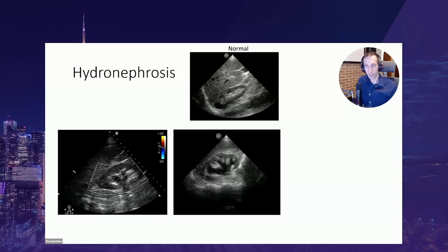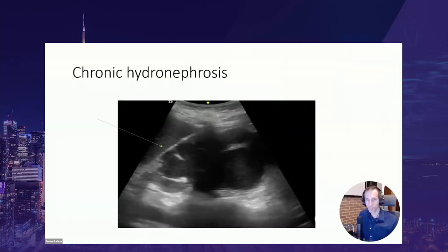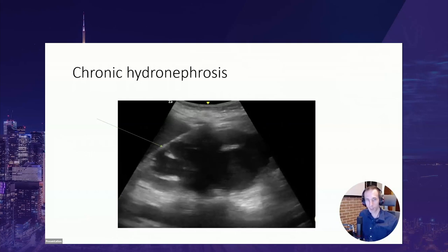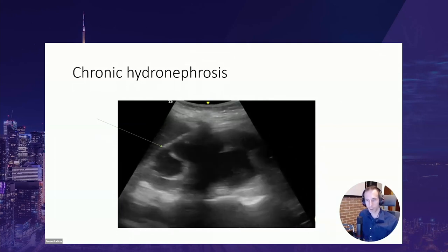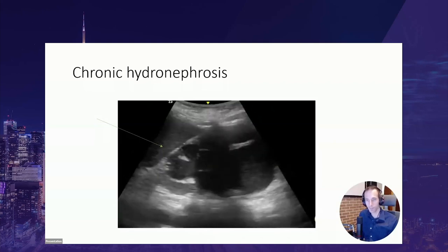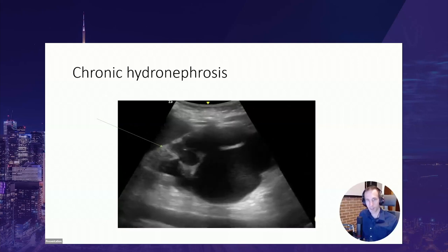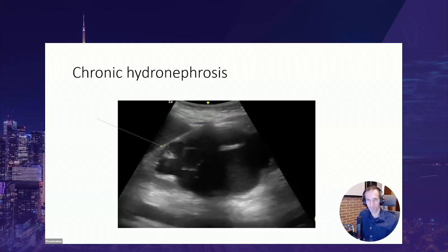Severe hydronephrosis shows ballooning of the minor calyces. When hydronephrosis is chronic and prolonged, the collecting structures are dilated but the cortex becomes very thin, indicating atrophy of the renal parenchyma. This can appear as an unexpected finding in patients with minimal urinary symptoms presenting with kidney failure.